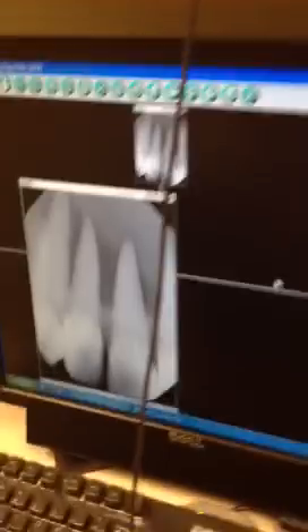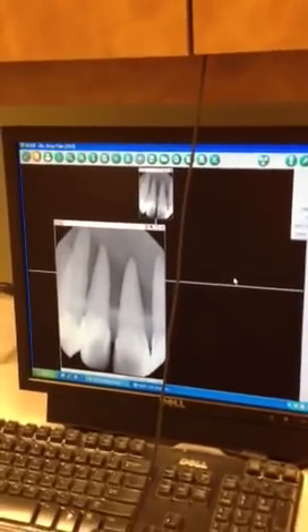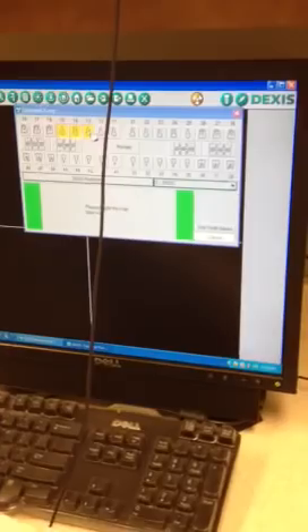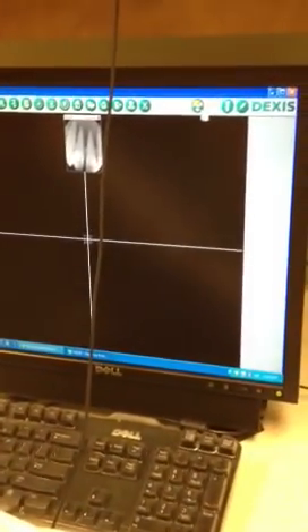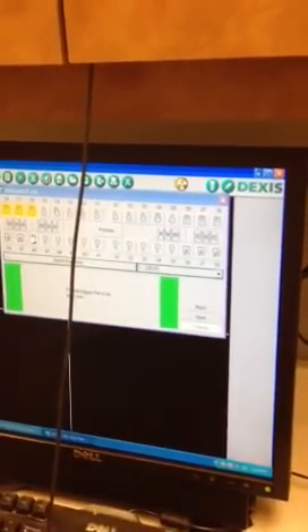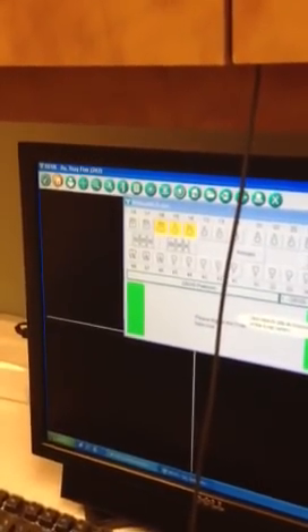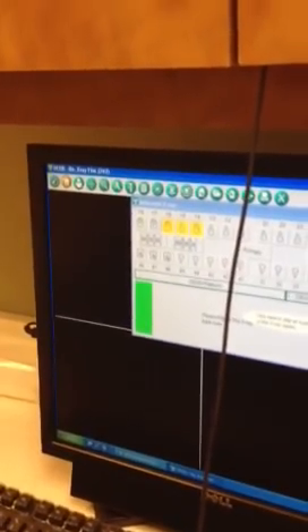Once we go back into the room we should see our radiograph. We'll have the client open their mouth. Then we'll press exit and we can go back in and choose another area to expose. If we're choosing to do a full mouth series with four bite wings, it will show you the sequence — starting on the upper right. Once you expose it, the image will show up and you'll click next. It will just guide you through the sequence, and you're able to take a full mouth series in about five minutes.